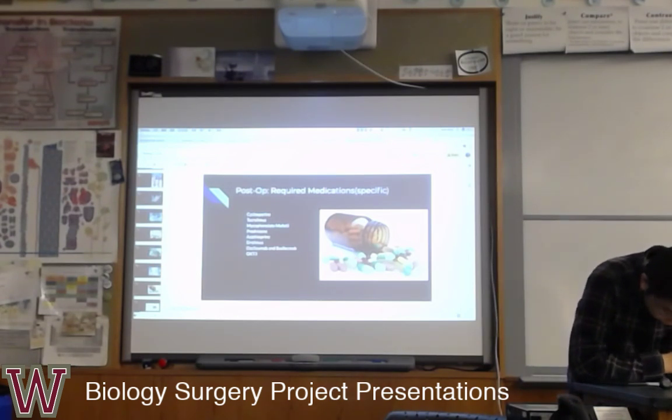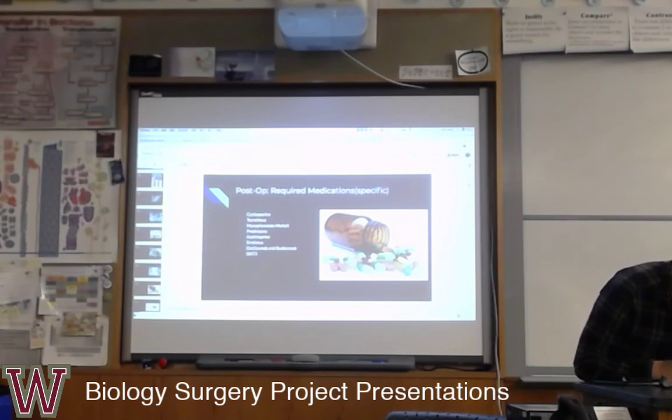Stop the blood from major arteries and veins. We can place a retractor between the skin to hold the opening, and then the ribs are now exposed. The ribs.